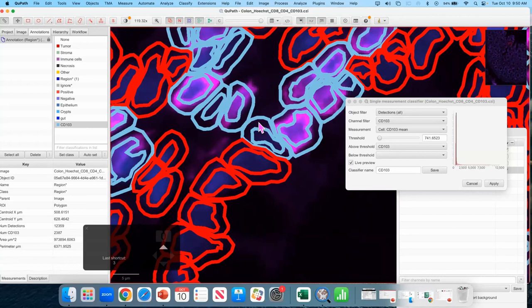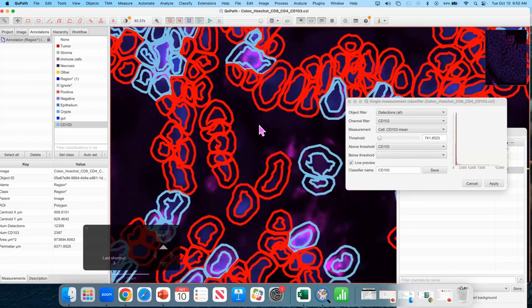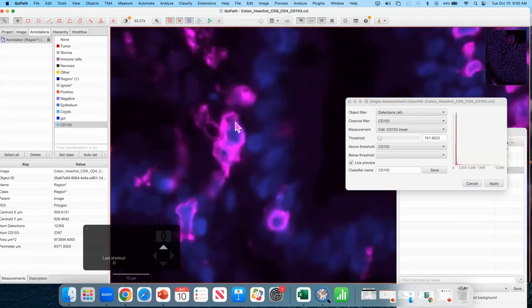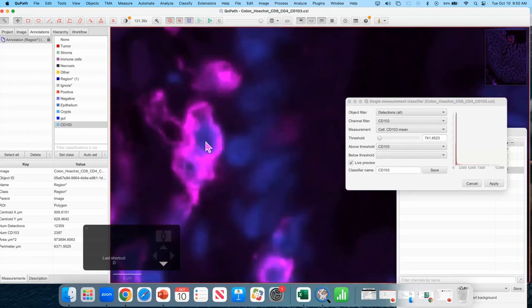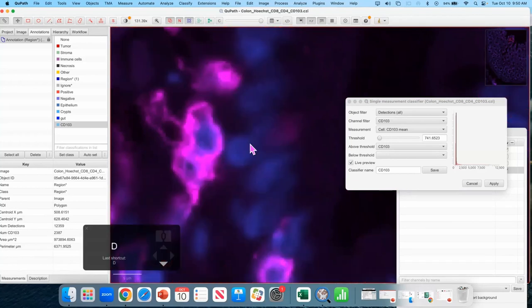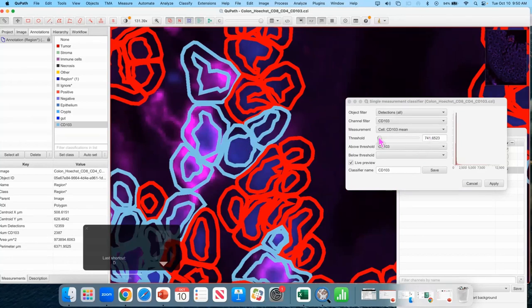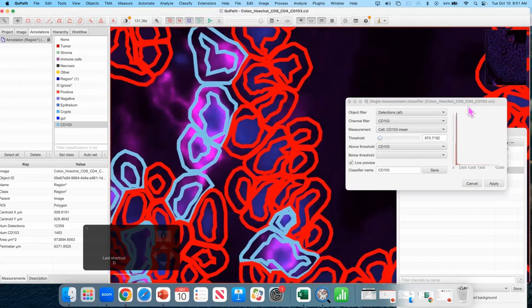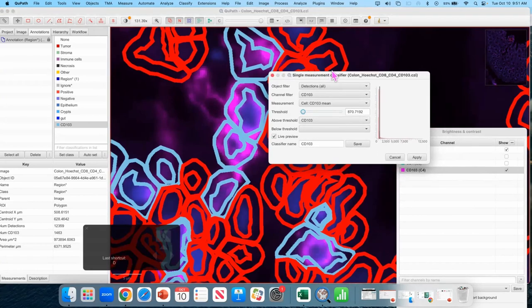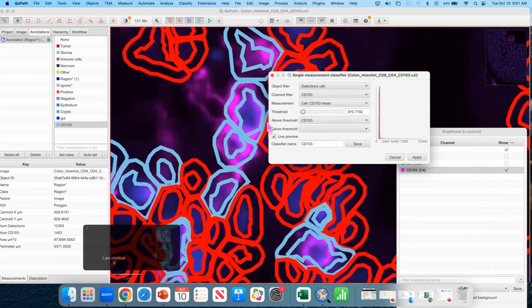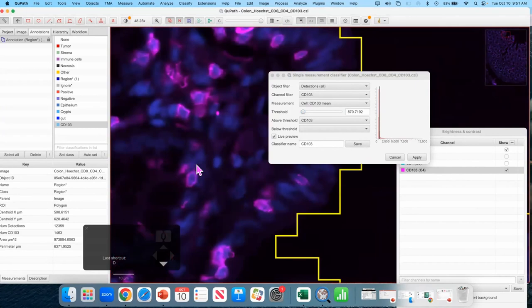And then I'm going to set my above threshold to cd103. That live updates. Hit like preview. Make sure your detections are on. And now the red cells are negative and the blue labeled cells are what it currently considers positive. QuPath attempts to do an auto threshold based on I don't know what math, something okay but I usually do want to change it in one direction or another. So what I'm going to do is go through turning the detections on and off with the button D and seeing if I'm having more false positives or more false negatives. Here I seem to have a bunch of false positives like these two cells here. So I'm going to raise the threshold which you can do like that. Oh immediate feature request. Sorry we have to do this in the middle of the presentation. In the brightness contrast histograms you just added a log button. Can you make this log? Maybe. Okay.